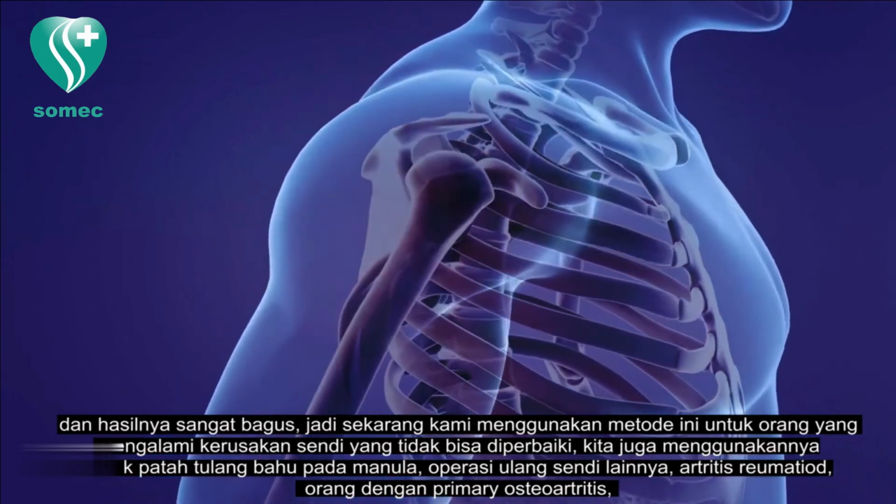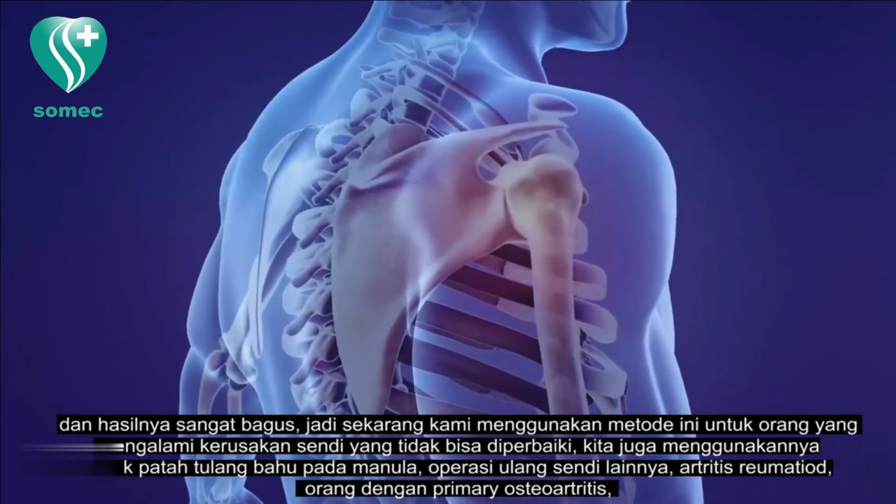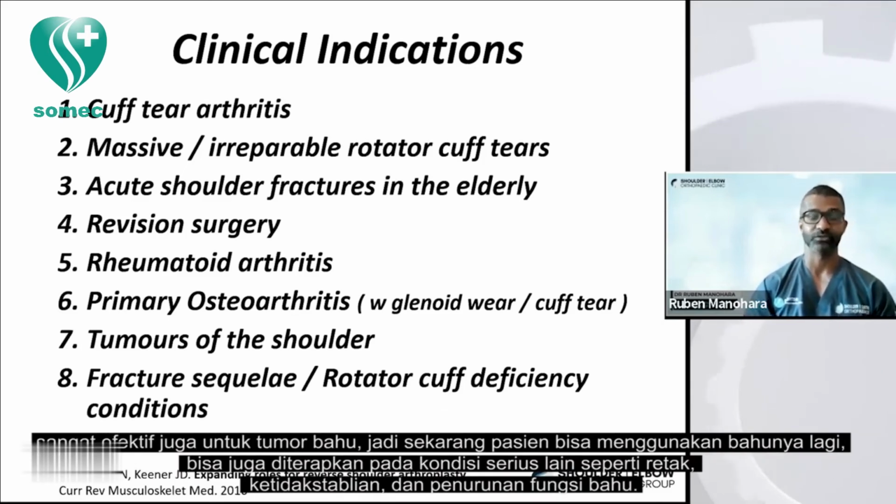Let's say if there's a failed fracture fixation or a failed joint replacement, the reverse shoulder can be used for the revision. It's used for people with rheumatoid arthritis. It can be used for people with very severe primary arthritis or with cuff tears in the primary arthritis. It's very useful for tumors of the shoulder. So now the patient can have limb salvage and can still have a functioning shoulder joint. And it can be used for all these chronic conditions after a fracture or instability or rotator cuff problems as a very reliable salvage option.